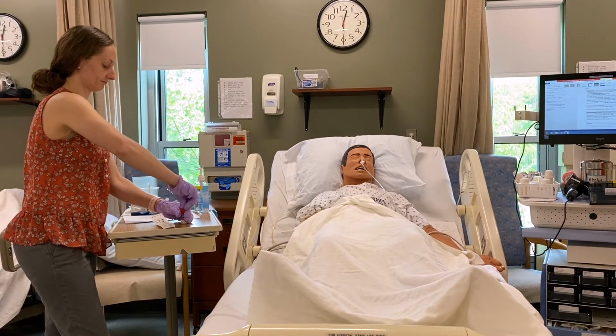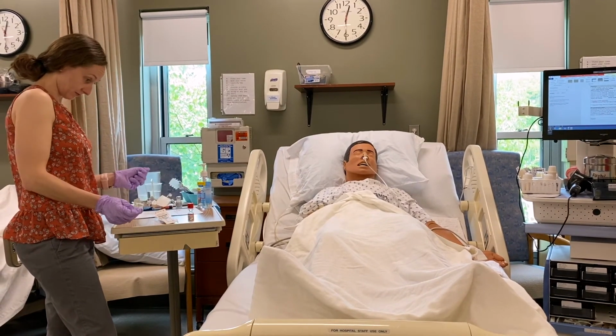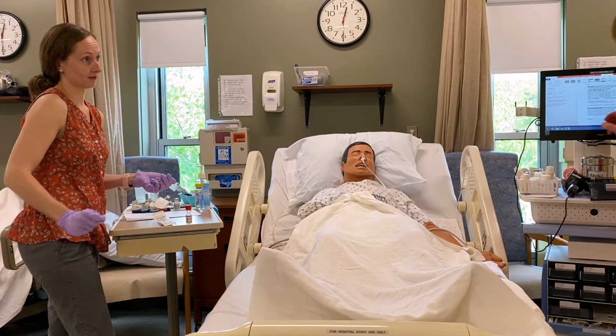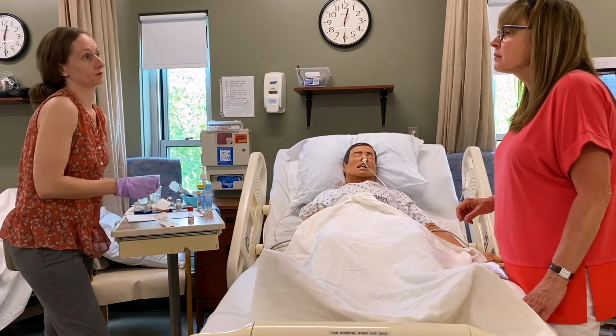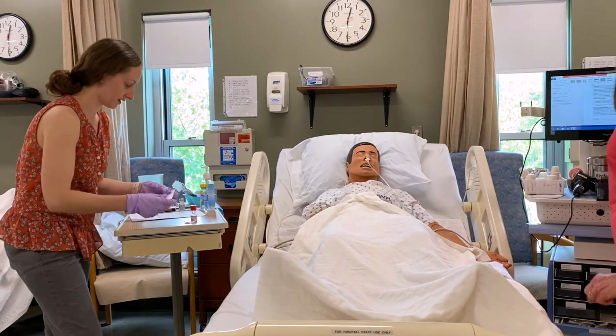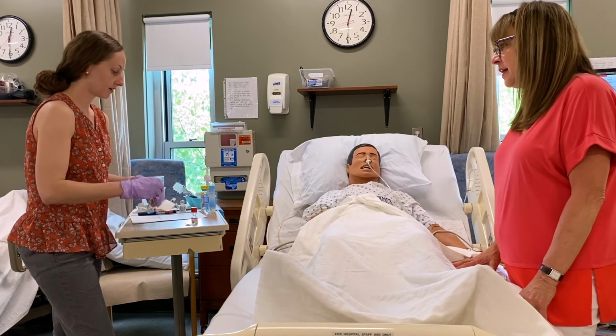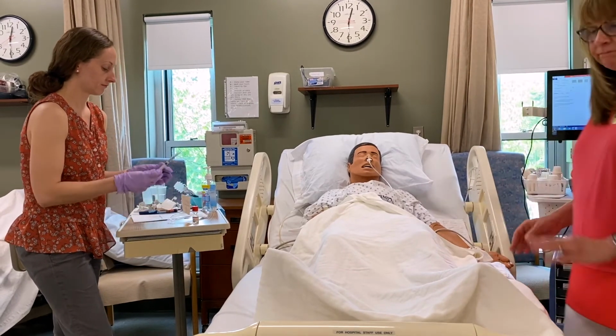So where can you give this? It's over 1 ml and he's an adult, so it needs to go in the ventral gluteal. Perfect, ventral gluteal, with a 1 1/2 inch 22 gauge. And will you aspirate with this? I will. Great.